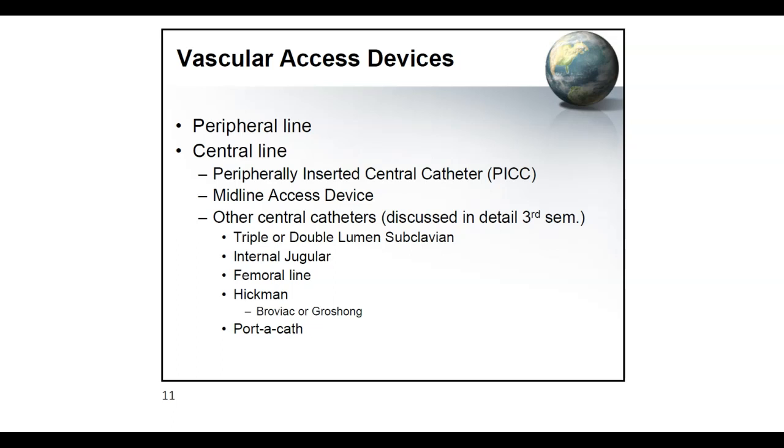There are times that maybe a patient is a hard stick, or maybe they're requiring long-term IV therapy. Then they may decide to put a central line on the patient. Or there are times also in cases of emergencies, it's usually easier to give the patient's medications through a central line. Maybe they need to give a high volume of fluid, then they may need to put a central line.